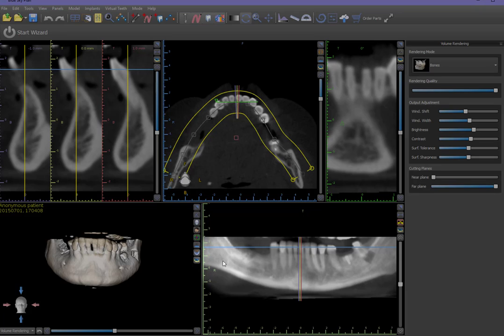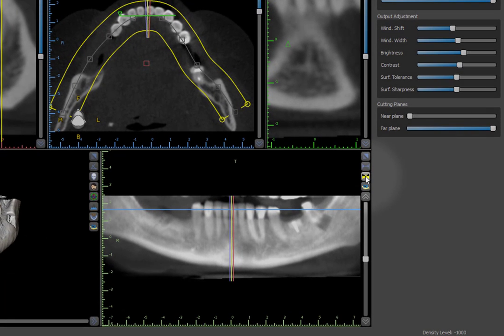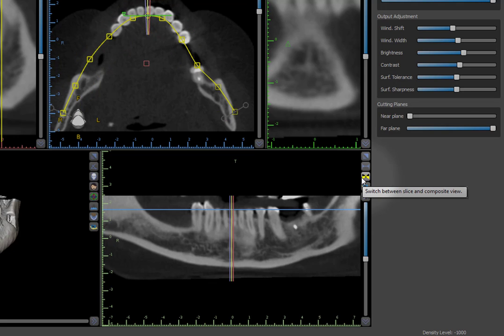Although mostly used for diagnostic and not image enhancement purposes, this is included in this discussion because it is related to image control. From the vertical toolbar to the right of the panoramic image, left-click on the third icon from the top. This slice composite icon will toggle between these two views.